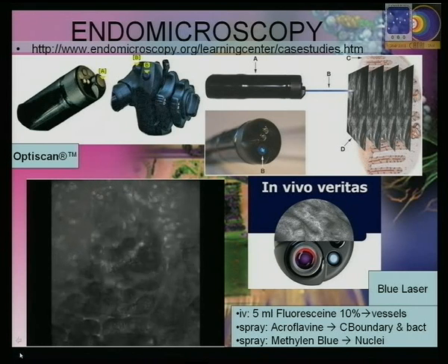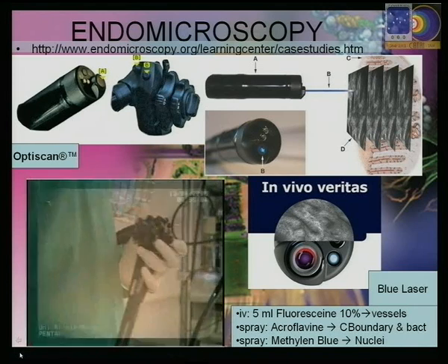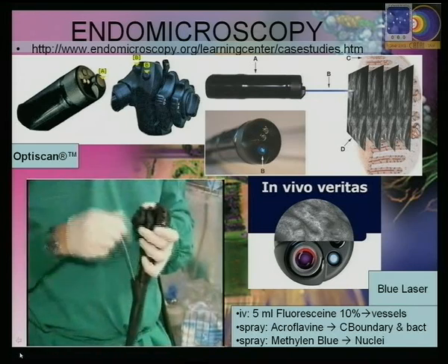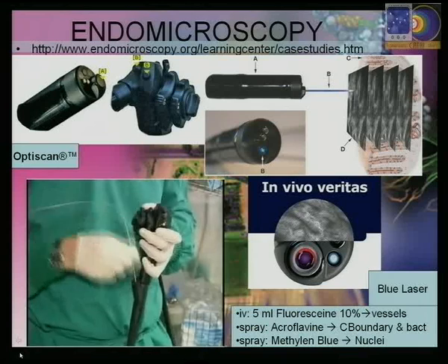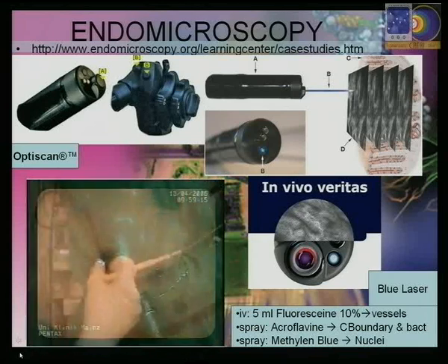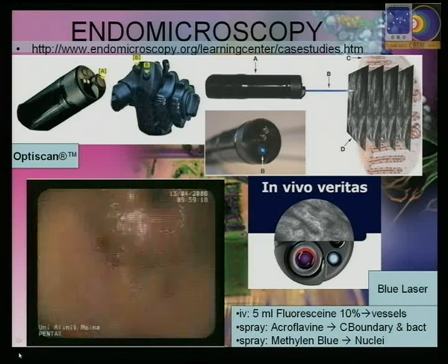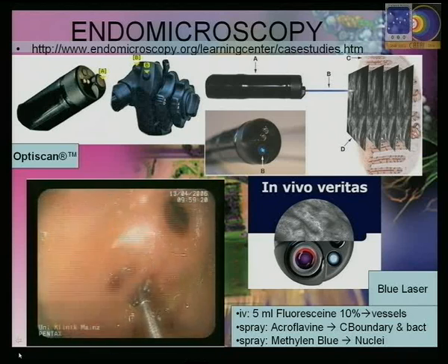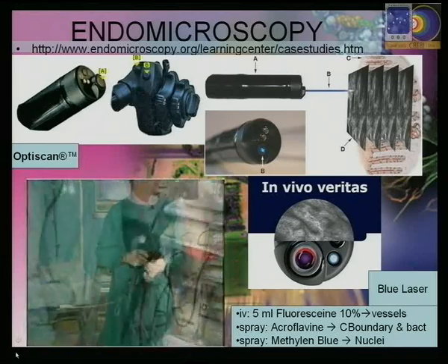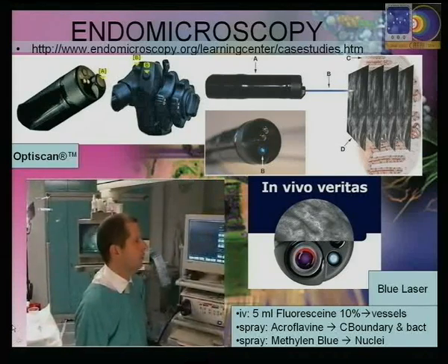The confocal endomicroscope is positioned in the lower left corner in the endoscopic view. During confocal imaging, suction can be applied through the working channel to the tissue in order to minimize moving artifacts. The working channel is localized at the right lower corner. Thus, biopsies should be targeted at the left side of the suction marks to obtain corresponding specimens for final histology. Ex vivo histology revealed Helicobacter positive gastritis. The patient was subsequently treated with antibiotics.